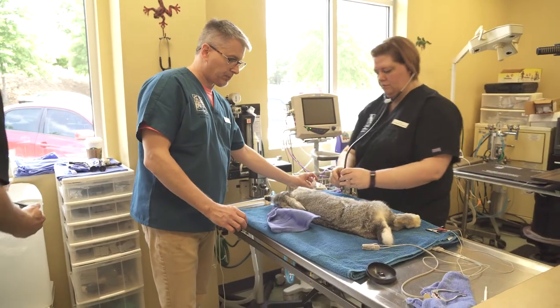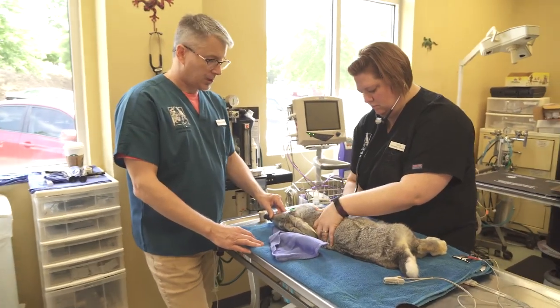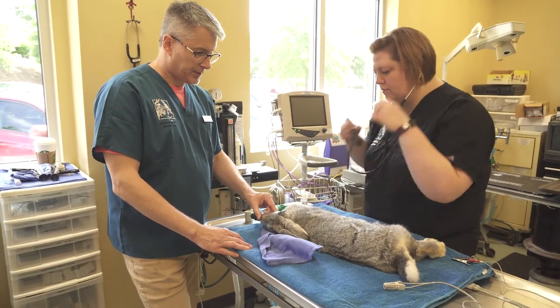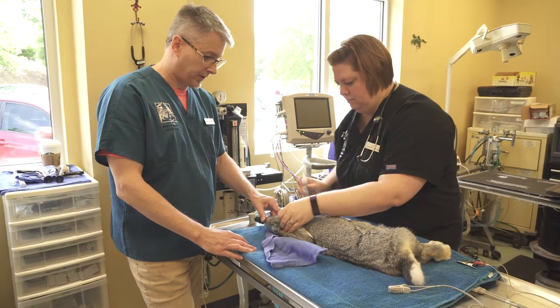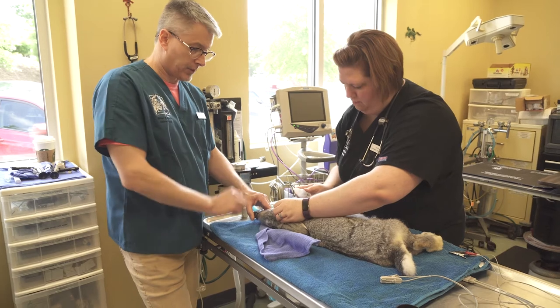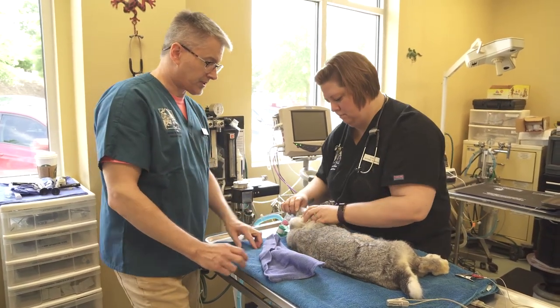Our rabbit has been pre-medicated with 5 mg per kg of ketamine, ¼ mg per kg of midazolam, and 0.03 mg per kg of buprenorphine. She's being masked down on sevoflurane, although isoflurane will work just as fine, just as good. We're using a face mask here.